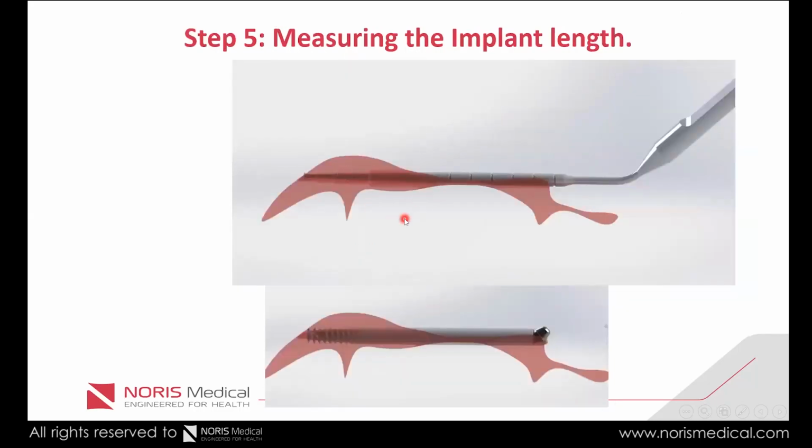Okay, so let's have the correlation between the depth probe and the implant itself. And this will be the correlation that we're looking for. What we actually want to know is where the center point of the multi-unit is going to be. When we look at the crest and we want to start measuring, we have to imagine where we want the multi-unit to be. Okay, this multi-unit is going to be positioned this way. We want to know where it is, and then we measure the distance from here to the position on the crest that we think the multi-unit would be.